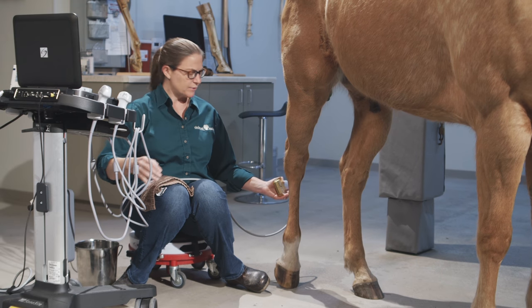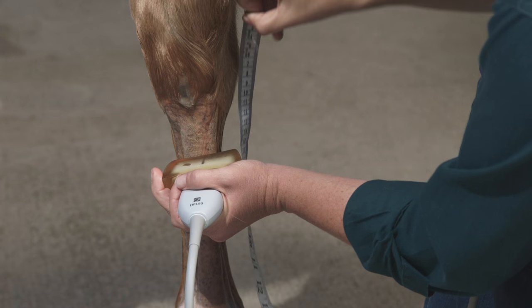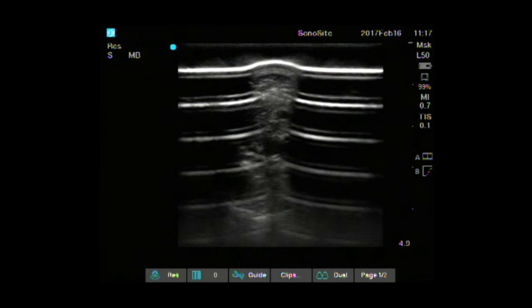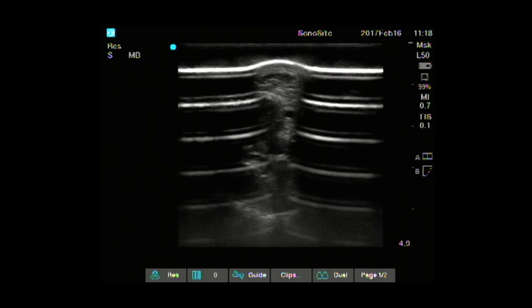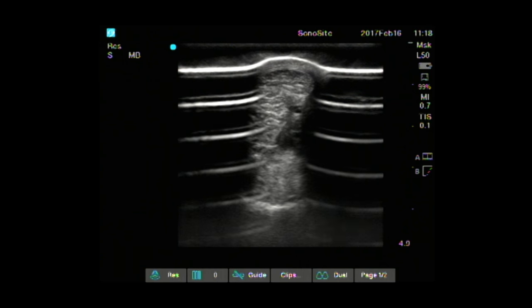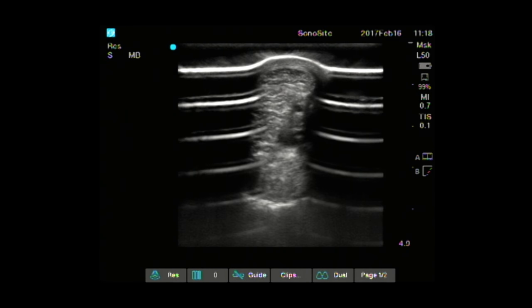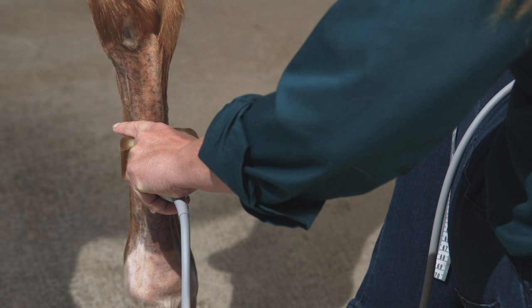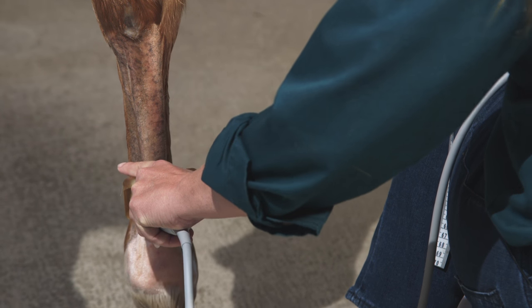Once I get to about 18 to 20 centimeters distal from the point of the hock — that's what I use my measuring tape for — the lateral splint bone is small enough that you can see the entirety of the suspensory ligament from the back of the leg. At that point, I swing around to the back of the leg and continue scanning the mid-body of the suspensory from that angle, all the way down to the split in the suspensory.